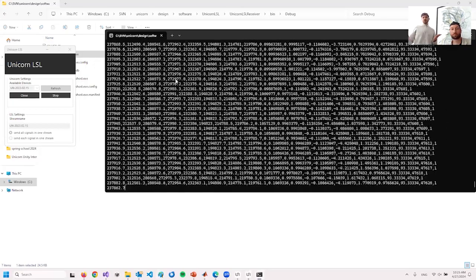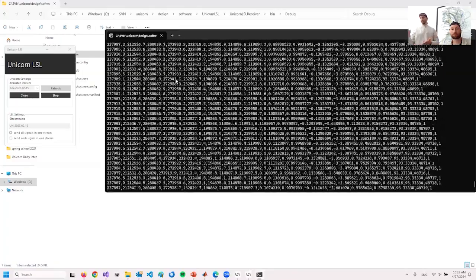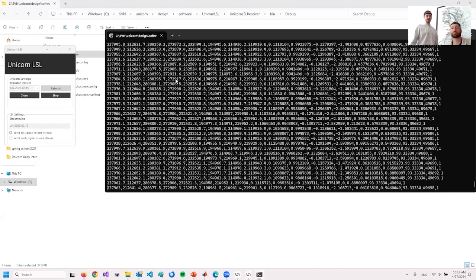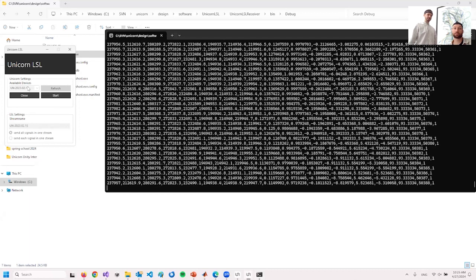You can also use that one to stream into your own application, into Unity for instance, or into some other framework that is supporting Lab Streaming Layer. If I stop now, also the stream stops.